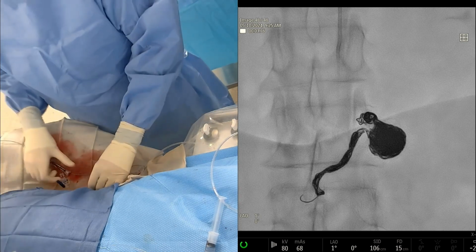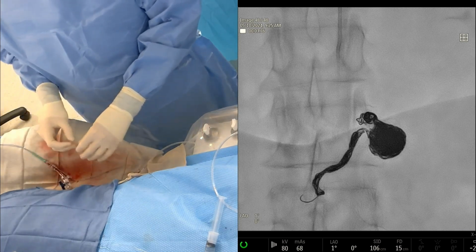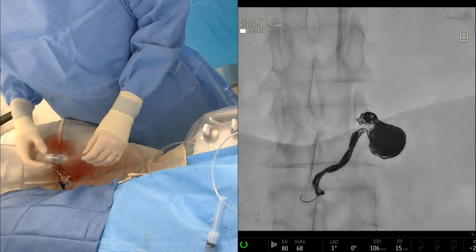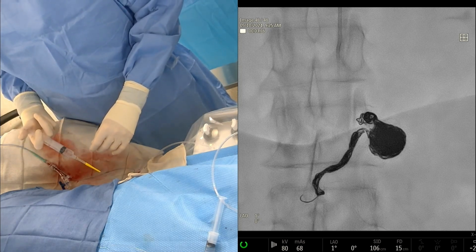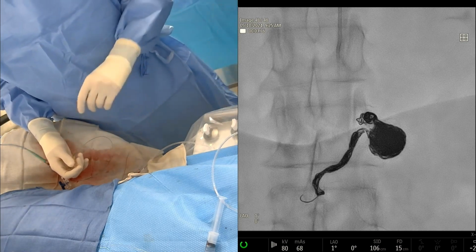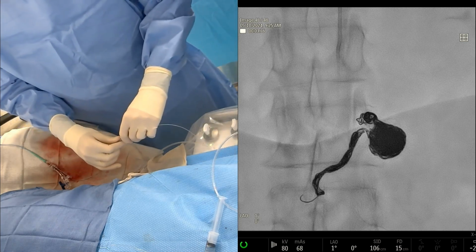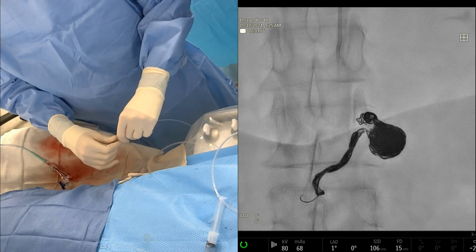We're going to use a 4 by 15 fibered coil to close. They do come in softs as well. I'm not a big believer in the soft coils. I know Aaron uses them for prostate sometimes. When you use a soft coil, it's probably better in smaller size vessels, maybe 4 millimeters or smaller. I find them really helpful in the 2 to 3 millimeter size, which is a much more appropriate vessel size than this. We like them for small trauma. The trade-off obviously is that they're unfibered.